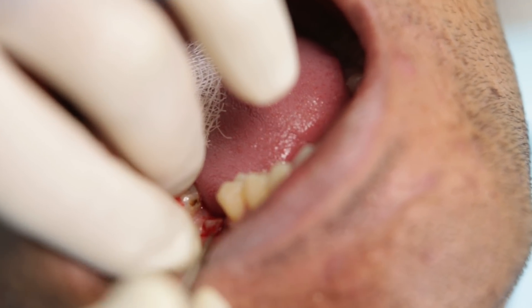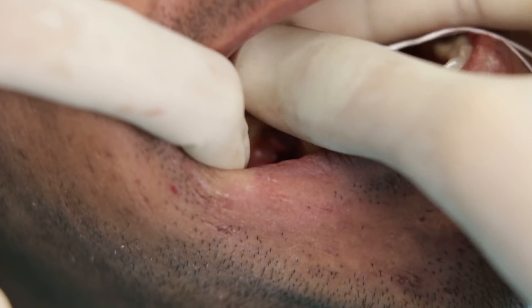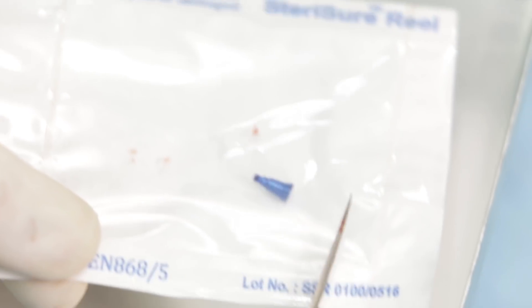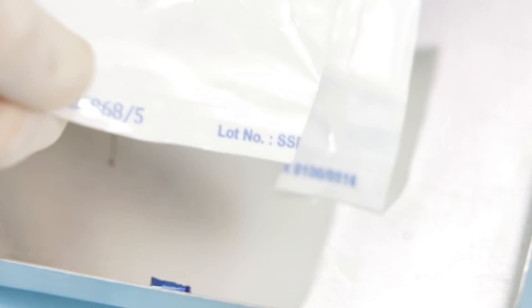All I have to do now is retrieve this tissue with an instrument and remove the cover screw. I will then place a gingival former and wait for the soft tissue collar to form.